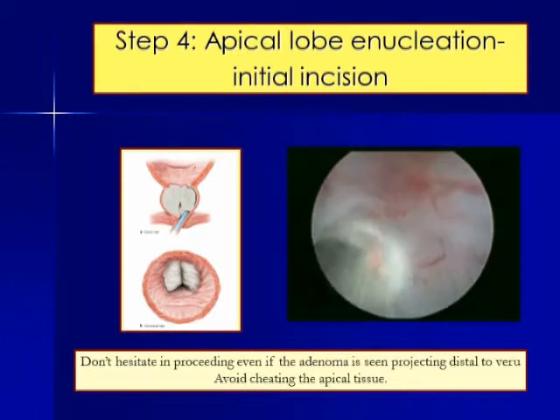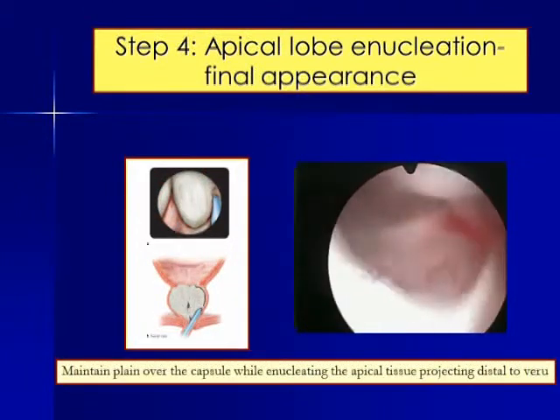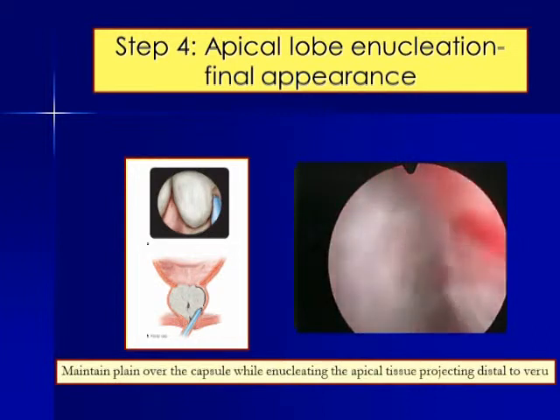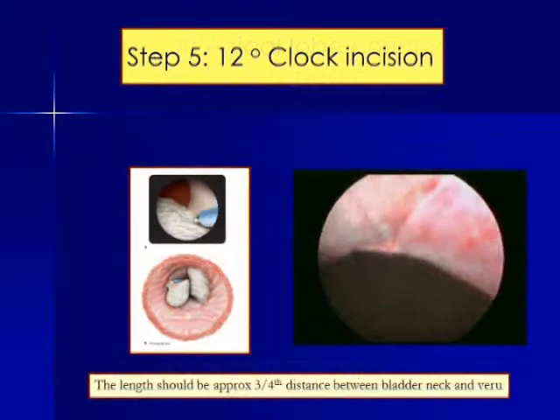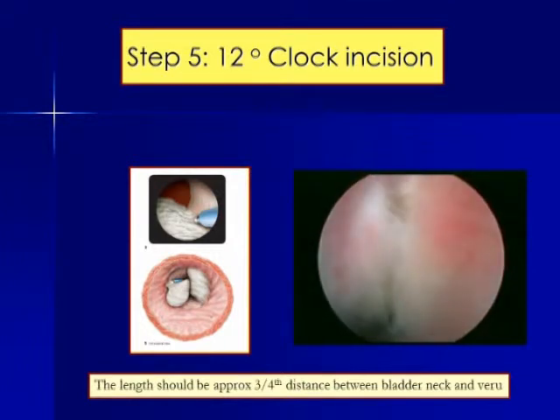On the right hand side towards me is the adenoma, and here we can see the capsule. This is how the apical tissue will look like at the end of the enucleation. In few prostates which are big, we may have to go almost 2 centimeters distal to veru to really enucleate the apical tissue completely from the sphincter. It's important to do that and not to cheat through the tissues so that we don't get lost in the tissue or lost in the prostate to start with.